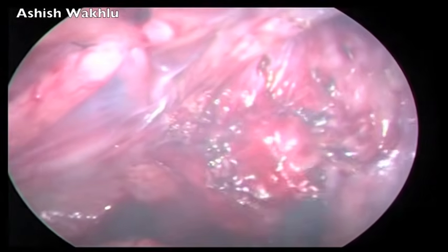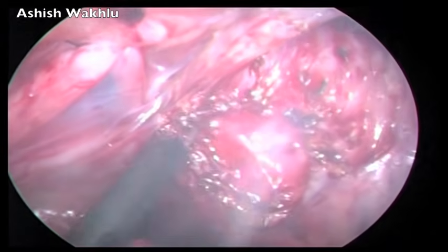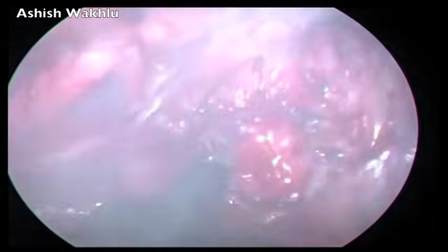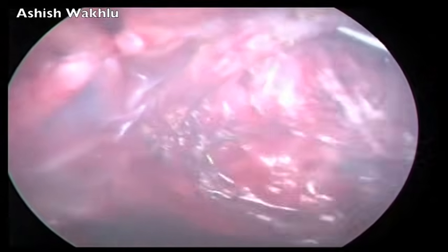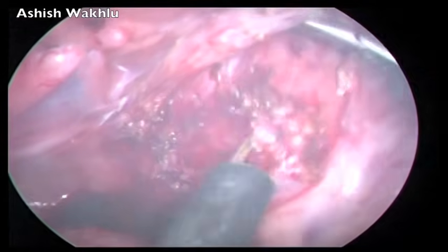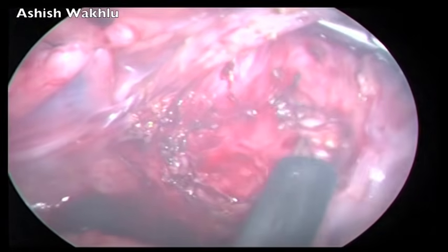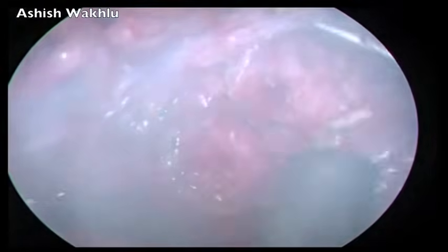With the mesentery of the rectum as thick as in this patient, it is a good idea to keep thinning the mesentery at one point where you feel the rectal wall is above, and eventually this will afford a passage through to the other side.